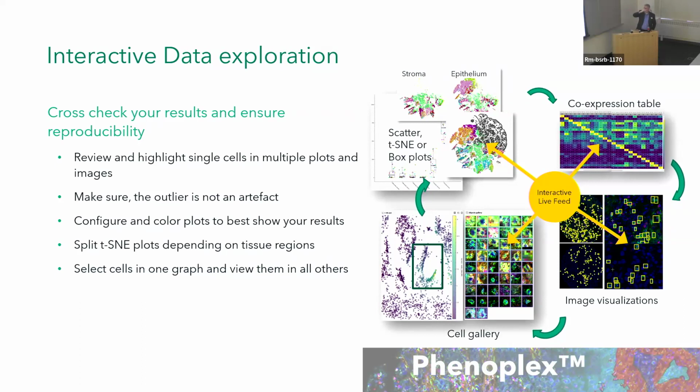We've also done something when you're setting phenotype positivity thresholds: we create this co-expression table, which allows you to see, from your control biomarker populations, the number of objects that are co-expressing two of your biomarkers. And if they should co-express, that number should be high. If it isn't high, obviously there might be something wrong and you need to go back and take a look. If they should be non-proportionally related, that number should be low. And if that number is high, then you may say, oh, do I have something going on with my staining? Do I have something happening with my segmentation?